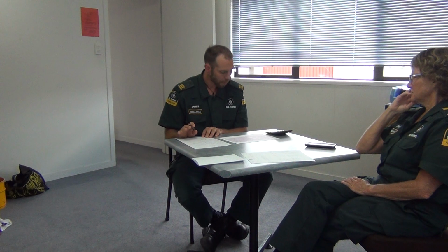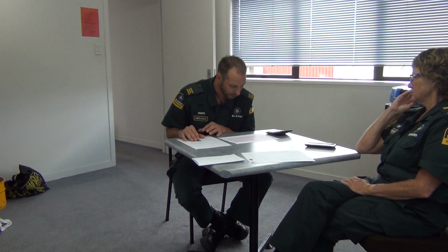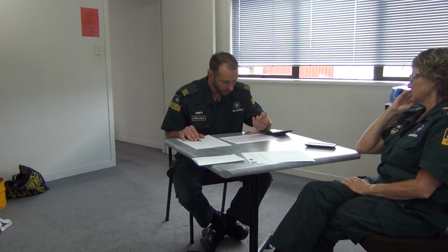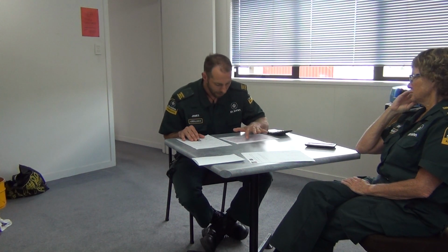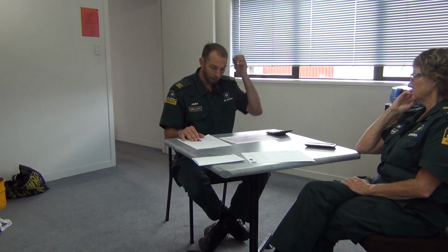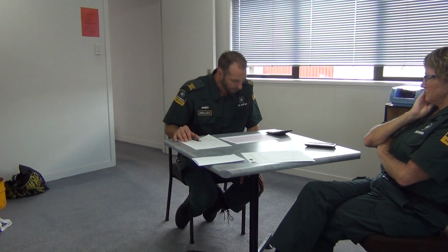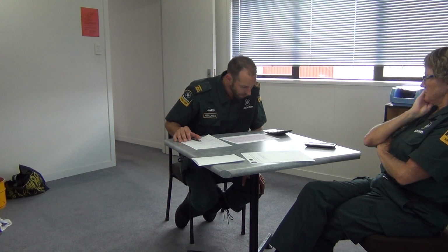At the moment, our concerning morphologies, I can see some elevation in a septal lead, which is V2, and some elevation in V3, V4 as well. However, I'm going to come back to that because I'm going to explain something else that's relevant to that. There doesn't look like there's any other concerning.